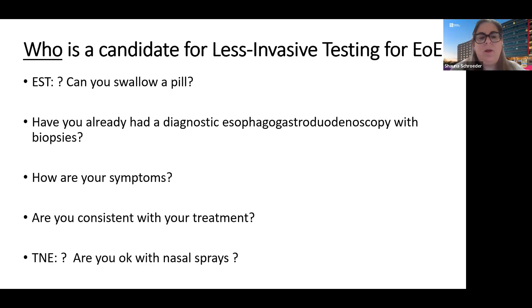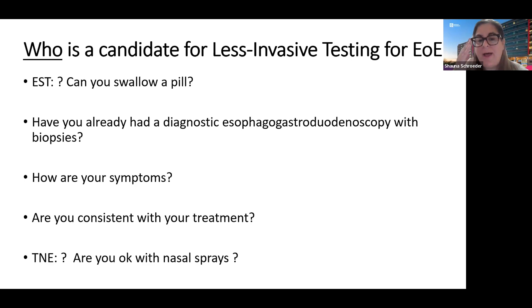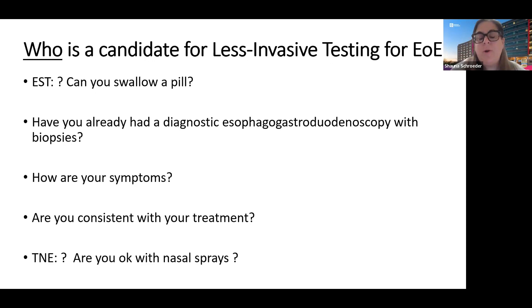For the string itself, can you swallow a pill is the big question. A lot of our patients with EOE can't swallow pills. So in the clinic prior to the visit, I'll often ask them to practice with a Mike and Ike or a jelly bean. Another important question is, have you already had a diagnostic endoscopy with biopsies? This is not a replacement for our diagnostic scopes, but a great alternative for surveillance and changes in treatment. And making sure you're consistent with your treatment — as your physician, if you're only taking your medication once a day or missing 50% of it, it doesn't really allow us to capture that information.